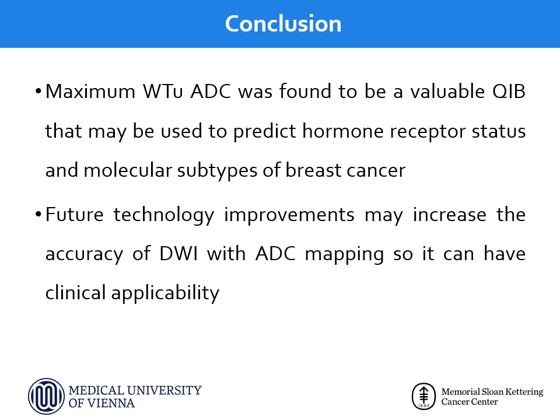In conclusion, maximum whole tumor ADC was found to be a valuable quantitative imaging biomarker that may be used to predict hormone receptor status and molecular subtypes of breast cancer. Future technology improvements may increase the accuracy of diffusion-weighted imaging with apparent diffusion coefficient mapping so it can have clinical applicability.